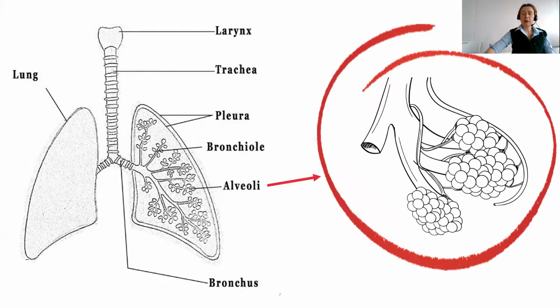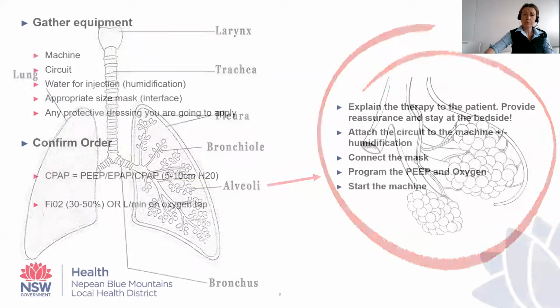Just a note, PEEP is used interchangeably with the phrase EPAP, which is also used interchangeably with the word CPAP. So they all mean the same thing. They are a positive pressure applied at the end of expiration.